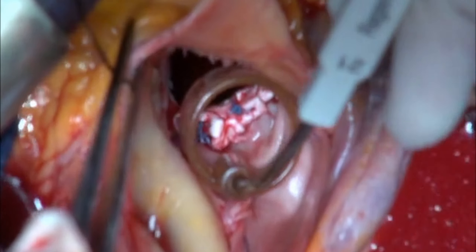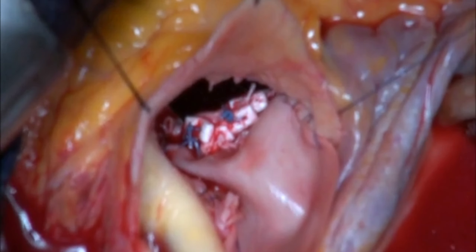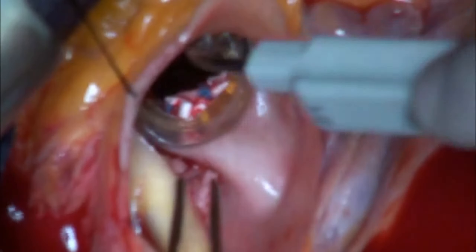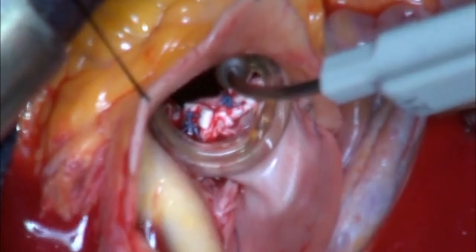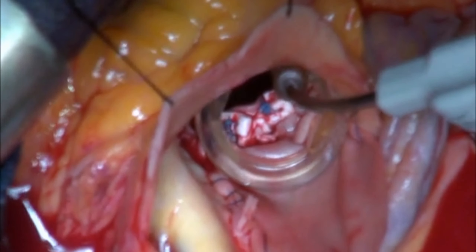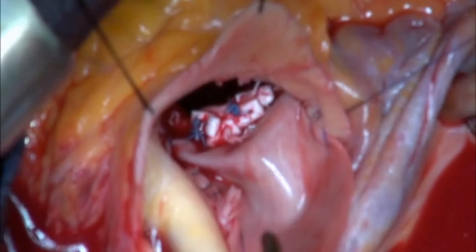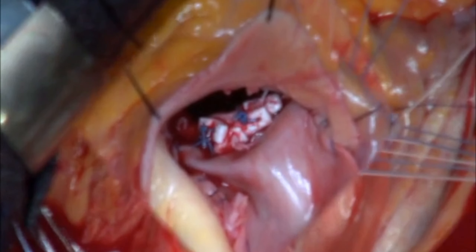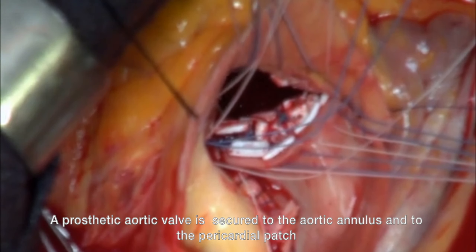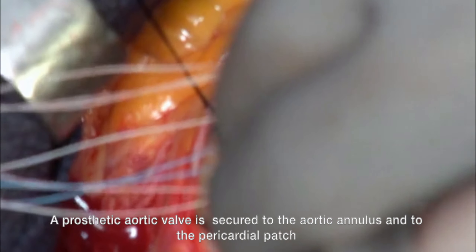We must size the aortic prosthesis using the location of the trigones as reference. The aortic valve should be implanted approximately one centimeter above the mitral valve to avoid excessive space between the prostheses.